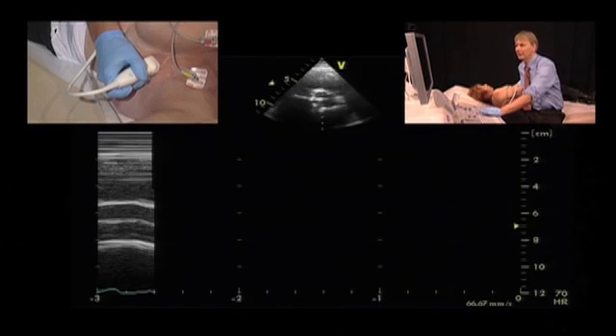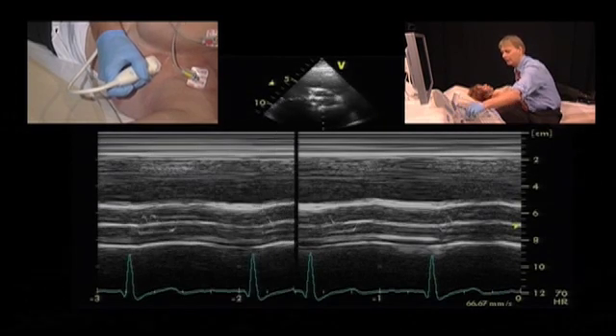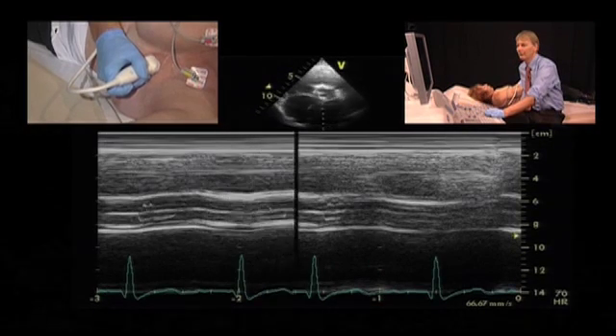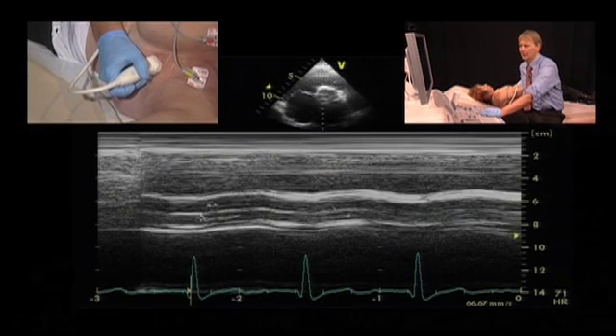What is also helpful is the M-mode, because if you perform an M-mode you would nicely see the typical pattern you would also see in a normal aortic valve with the box opening. And we do not have the artifacts that would be apparent in patients who have a mechanical prosthesis.